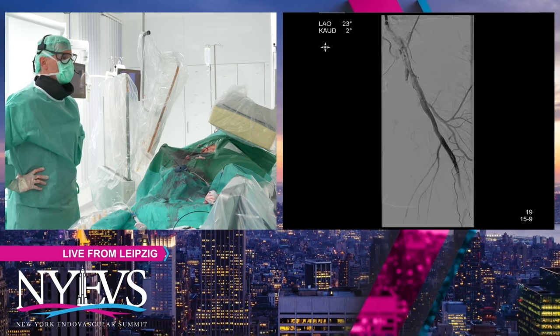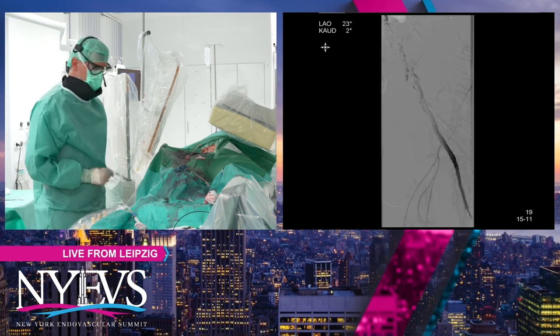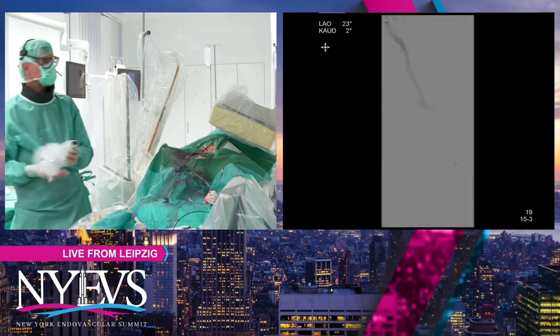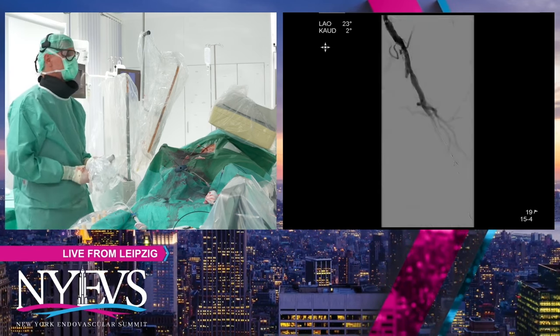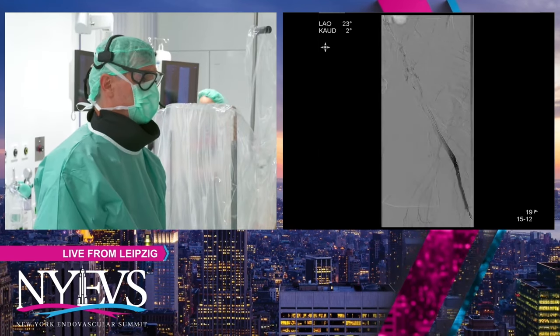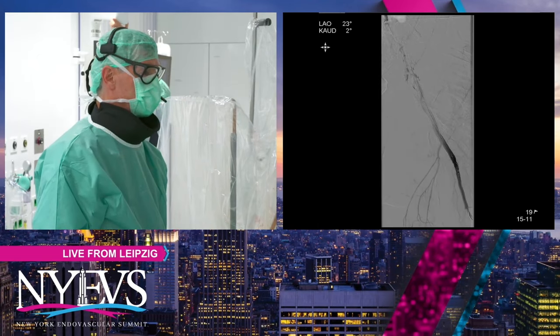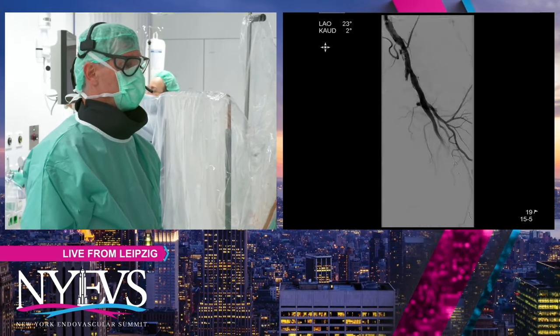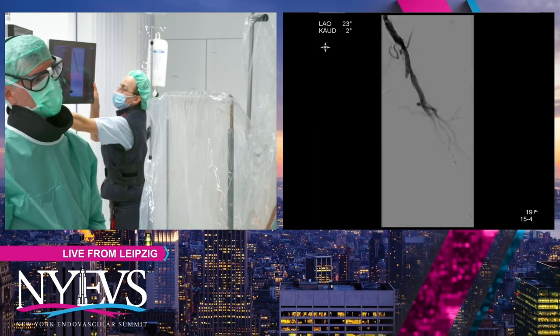Looks like you got significant debulking there, Andre, as expected. Yeah, not so bad, I would say. So what's your plan now at this point? What are you thinking? Yeah, I could take the filter out, but I can also leave it here. There's some debris in, yes. I'm going to continue with ballooning now of the common femoral.